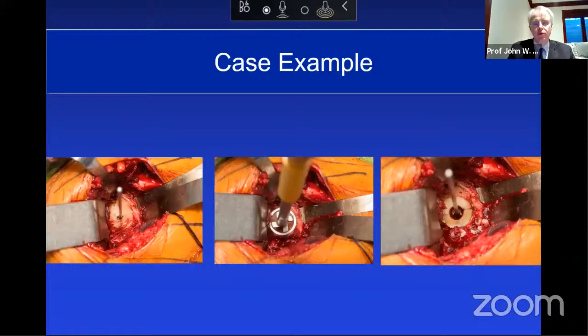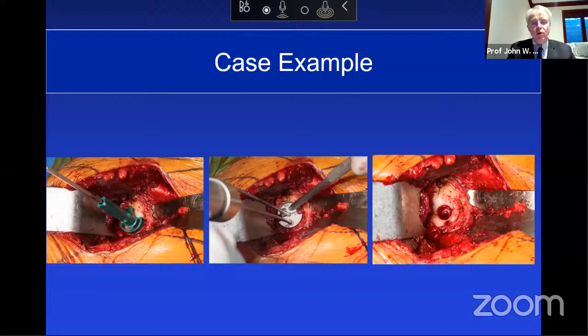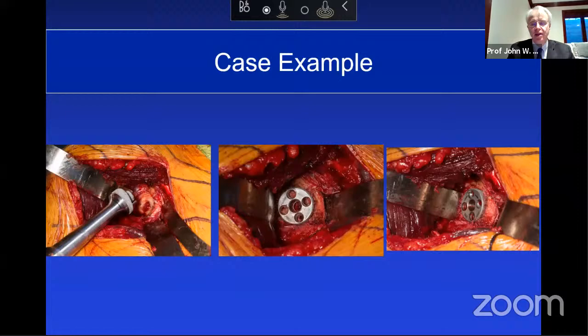So here's a technique, massive rotator cuff tear in this patient. What we can see, no arthritis. We ream the bottom part of the glenoid to 50%. And then what we'll do is we'll place the augmented base plate in there. We'll prepare it and place it in the same rotation. And then we'll be able to go ahead and fix it down. And you can see on the intraoperative view how we've created the tilt with the base plate.